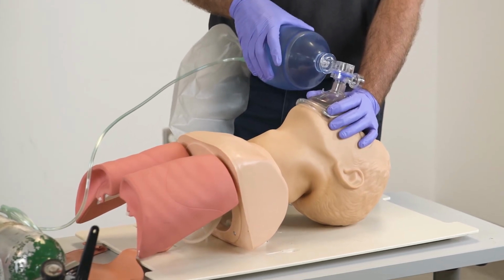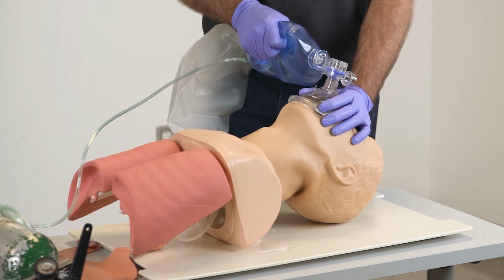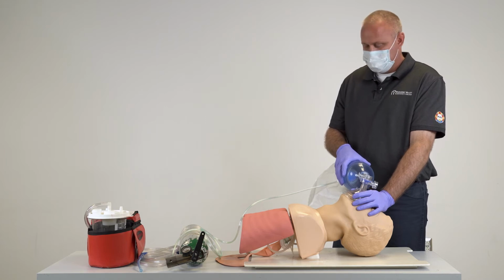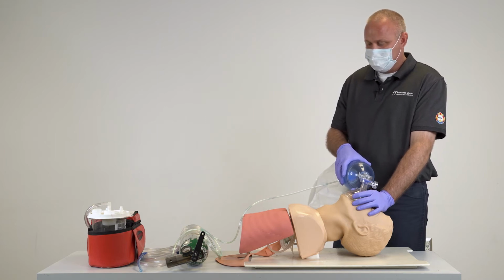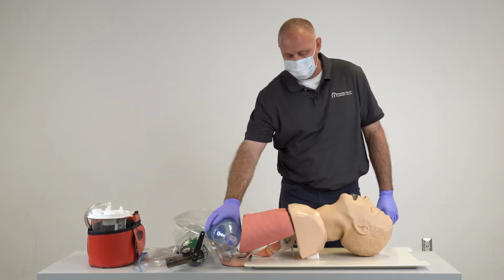1001, 1002, 1003, 1004, 1005, 1006. I'm going to ventilate 10 times a minute, once every 6 seconds, and I'm going to do that for about 2 minutes. After my 2 minutes, I'm going to go ahead and reassess for a pulse and breathing.